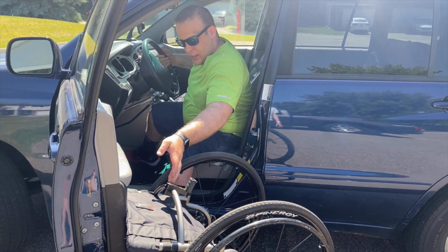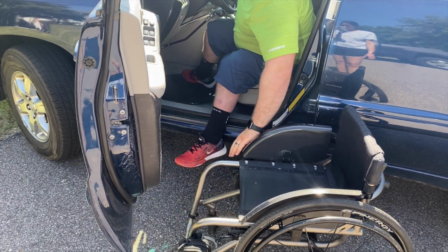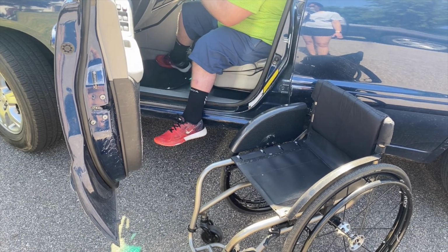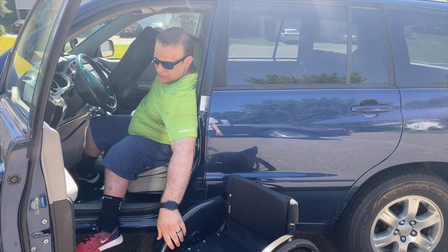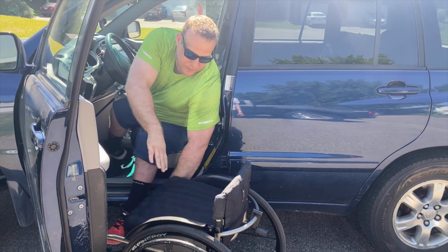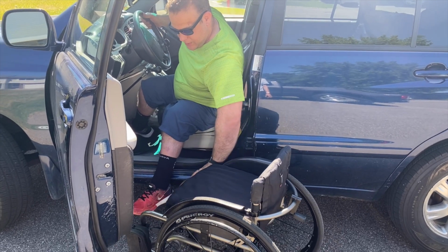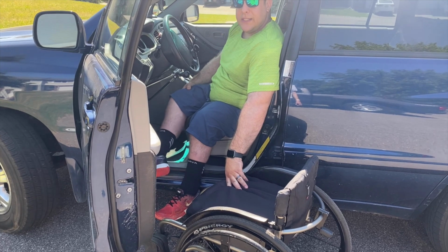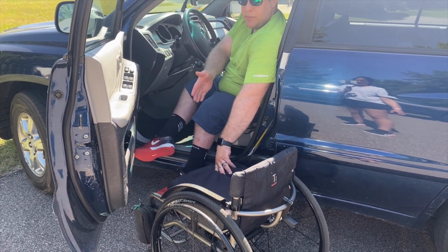And then get the chair down like this, get one brake on so it doesn't roll away from me, just make sure it kind of props itself against my car. And then the last thing we do is get my seat cushion and get that all situated. And then for my transfer, I might adjust my chair a little bit. For me, I get my legs free of the car first, both of them down there, so they don't get hung up as I move forward.